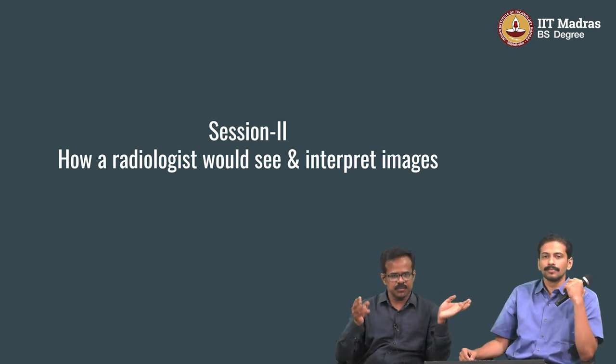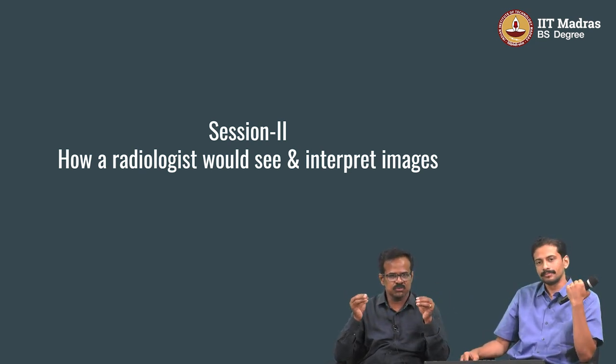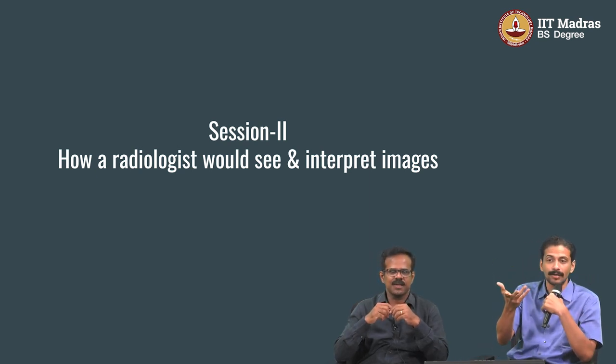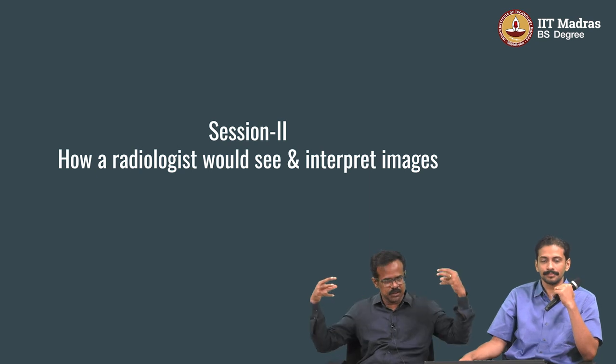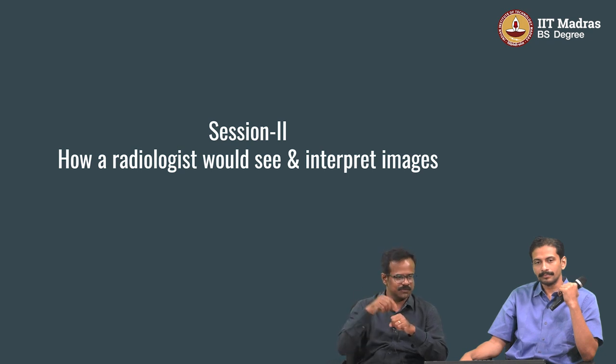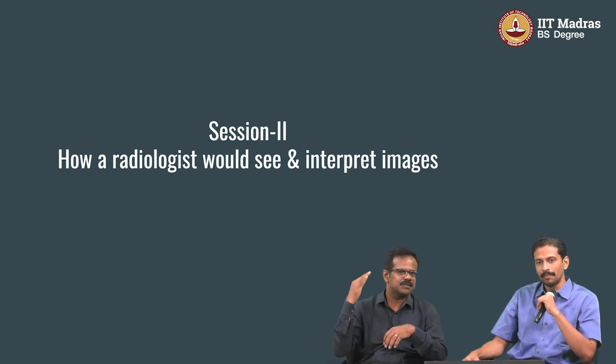Right. The same ultrasound is used to burn tissues inside the body. That's high intensity, high frequency ultrasound with multiple focus. If you focus at a point, the cumulative energy is so much that it will burn the tissues. We are using it for other purposes also. But as such, a single ray going in and reflecting is not harmful.